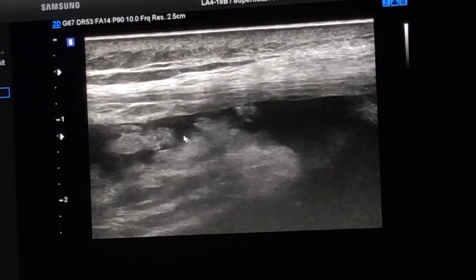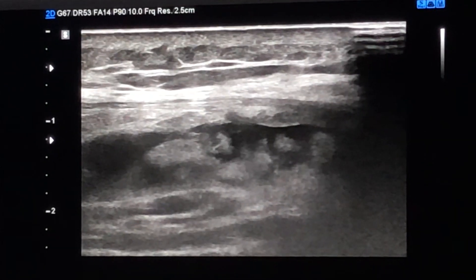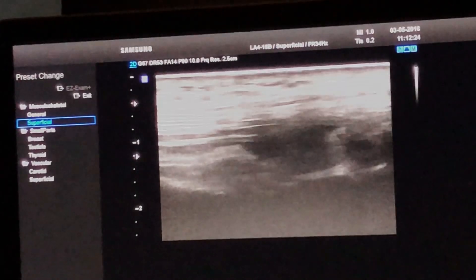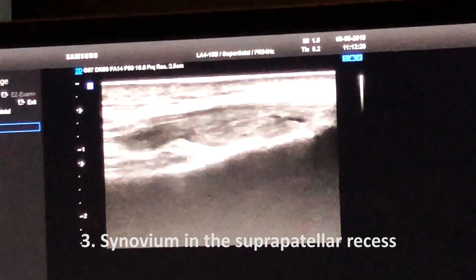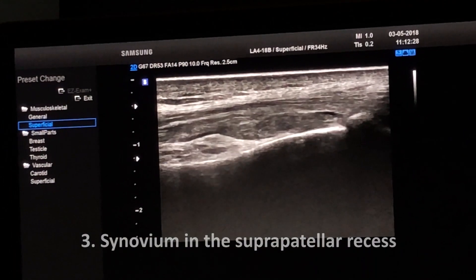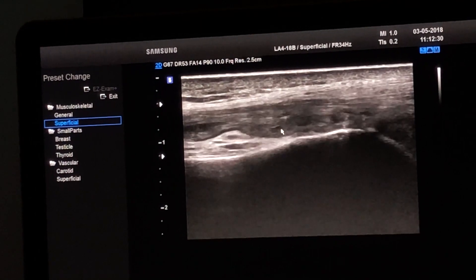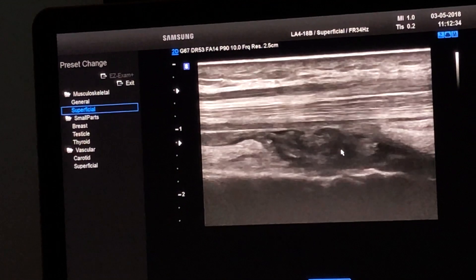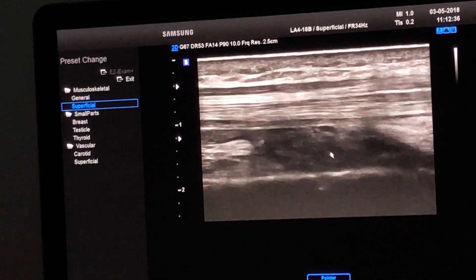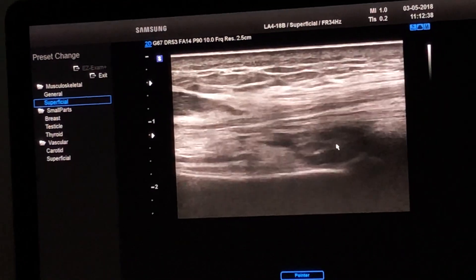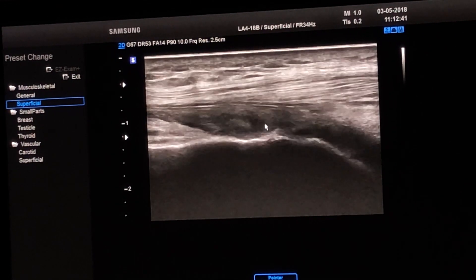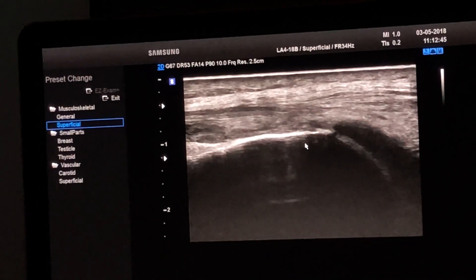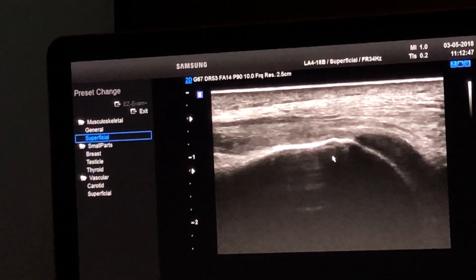Any idea? Differential diagnosis? At the joint space you see synovium — this is the typical appearance of synovium. The tissue you see here is synovium. It's more compacted than in the other case, but look at the echotexture — it's totally different. It's not as bright as the leaves we saw in the previous patient.